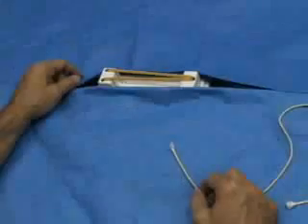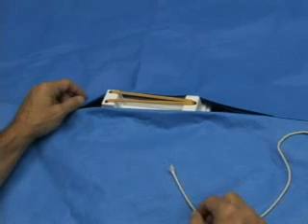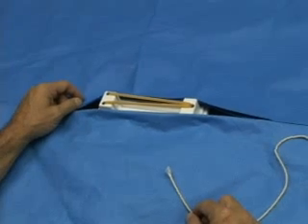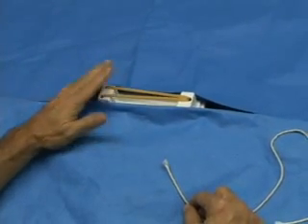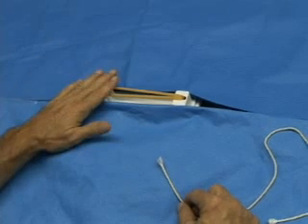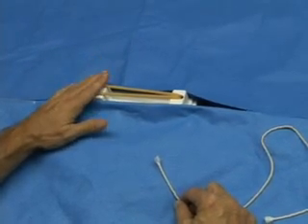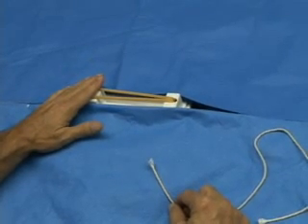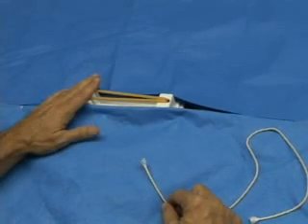This is a basic knot tying practice board provided by one of the suture companies — the name of which we've covered to keep this a non-commercial video. But it's very handy to use. You can practice on these; they're available in the medical school and in all the different hospitals. Or you can practice on a button on your shirt, on a chair arm, or anything else.